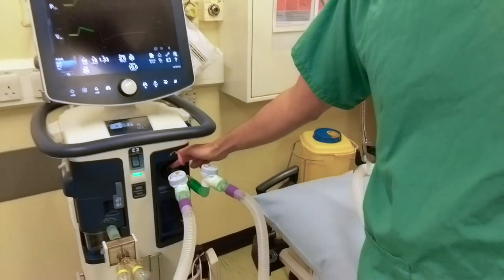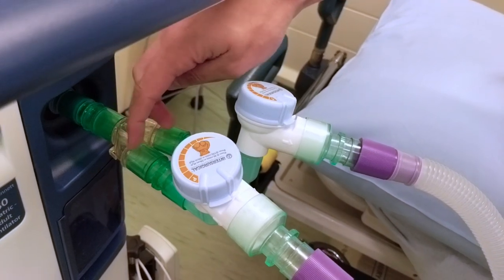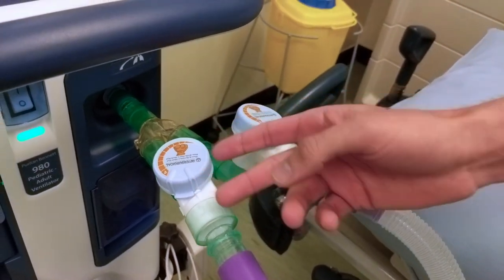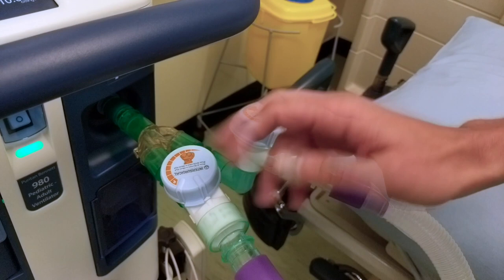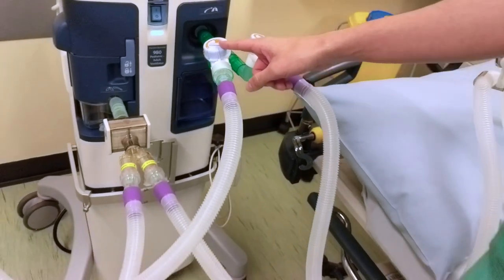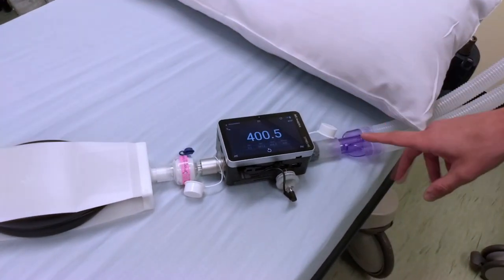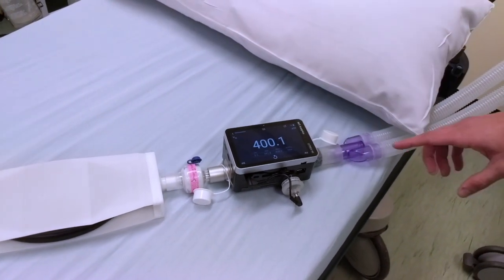On the inspiratory limb, as the gas leaves the ventilator, it encounters a Y connector. Just after the Y connector splits between the two limbs, we have an adjustable APL valve. These ones, which we've completed testing on, are pediatric Intersurgical APLs, and we like them, and they've got teddy bears, and that's all good. Then, as soon as the gas passes through the APL valve, which in this configuration is completely open, it goes through the inspiratory limb and meets the area where the patient would be. This is slightly different than it would be in the final form, and I'll talk you through the differences.